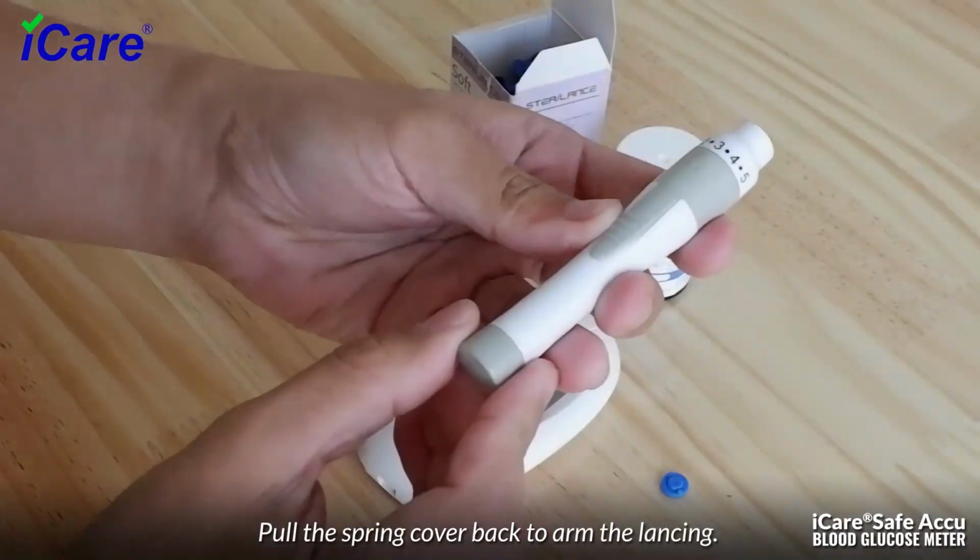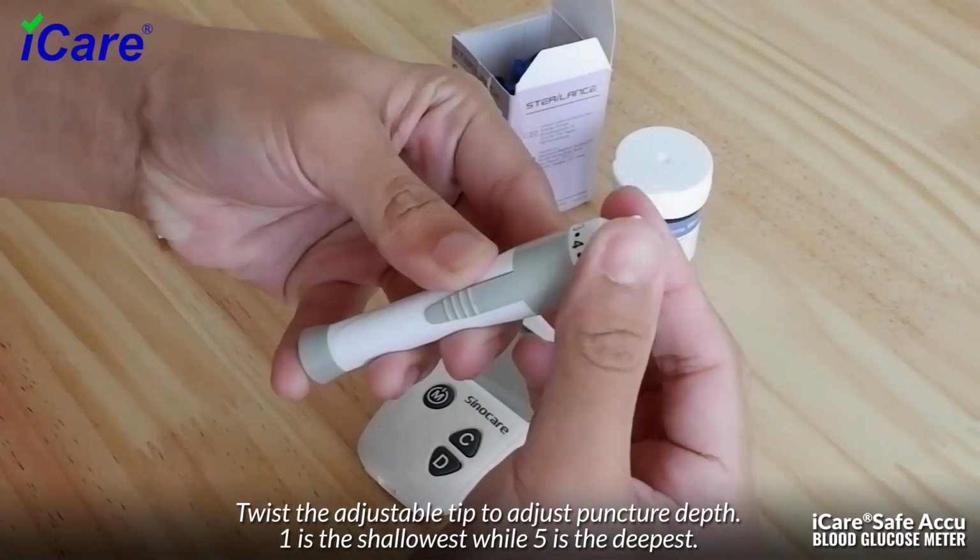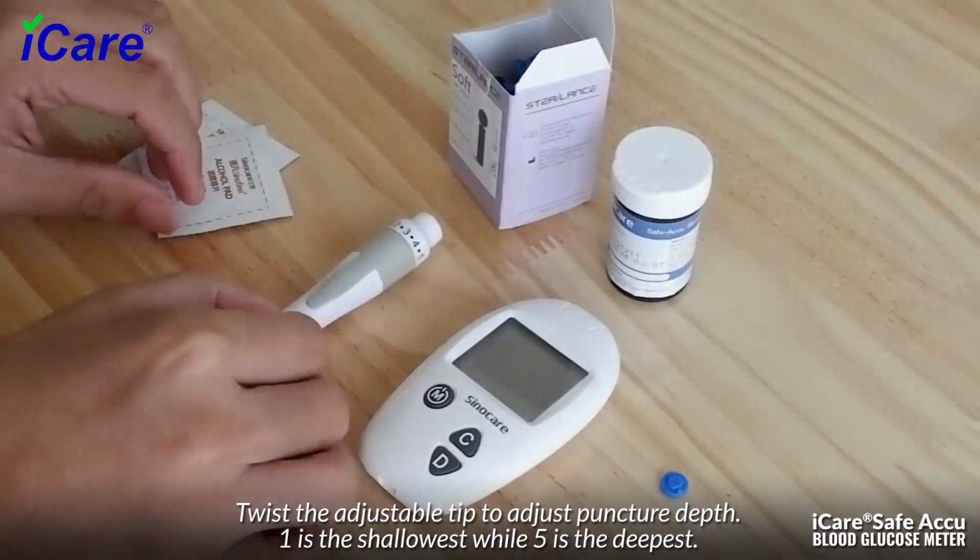Pull the spring cover back to arm the lancing. Twist the adjustable tip to adjust puncture depth. 1 is the shallowest while 5 is the deepest.